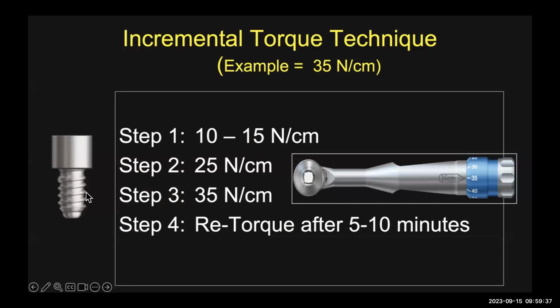Now, what is the bottom line? There is really no study out there that tells you that you can remove them and replace them 1, 2, 3 times. The problem is all screws are different. The pitch, the amount of threads, the thickness, the material differs. So you have to take all that into consideration.